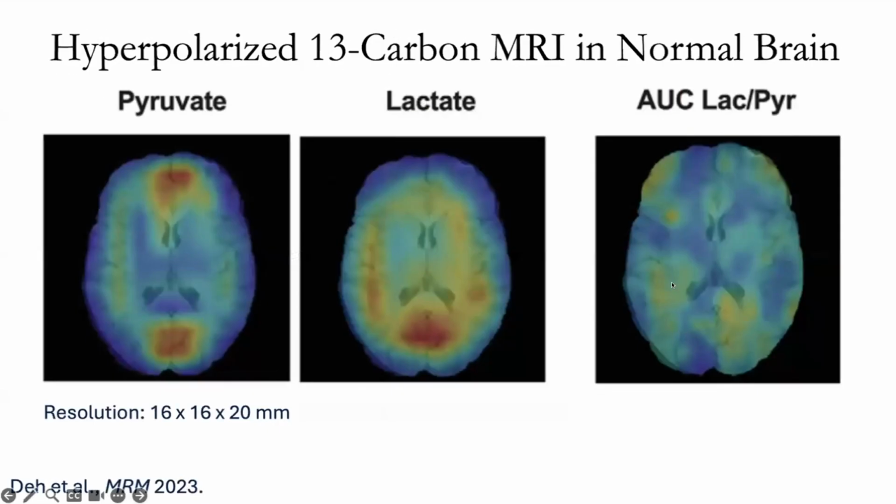But just as a baseline for normal volunteers, normal brain, if I were to show these kinds of results for our basic hyperpolarized carbon-13 experiments to my colleagues in the neuroradiology reading room, I think first they will panic, because anytime you show a neuroradiologist or radiologist in general a color map picture of something they're not familiar with, they get a baseline adrenaline surge of panic and disorientation.